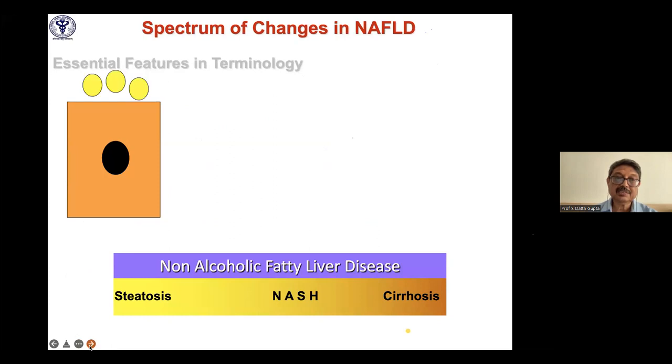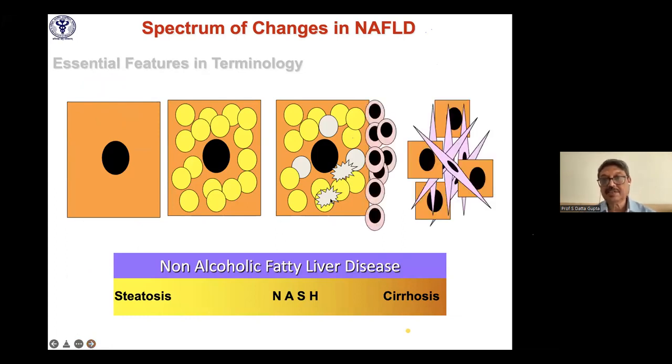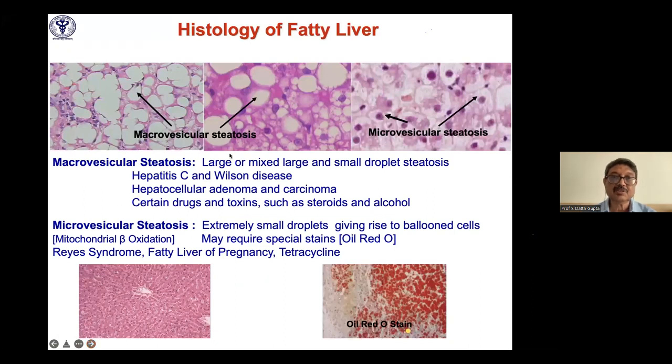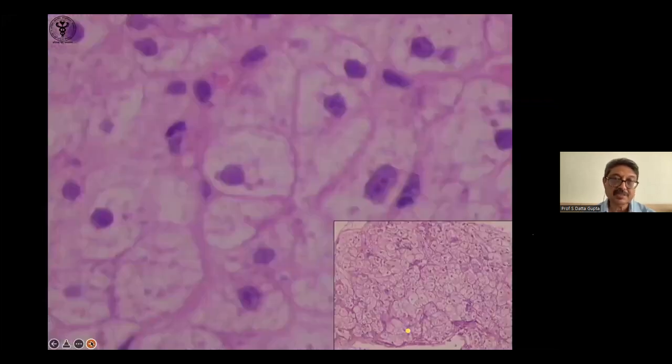In NASH, same thing, just like that. First you have fatty change, then you have steatohepatitis, and then cirrhosis or fibrosis. So this is the same thing, except that fat is present. The other thing in NASH which I want to tell you is you can have microvesicular steatosis, which is generally just like foamy hepatocytes. These are varying grades of fatty change. Portal inflammation is less.